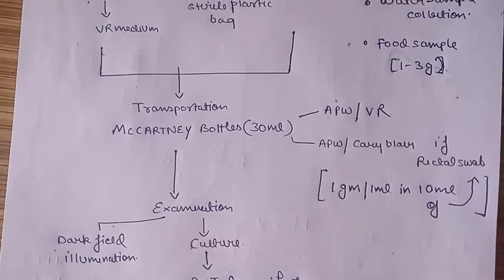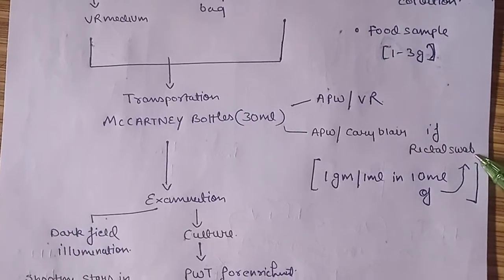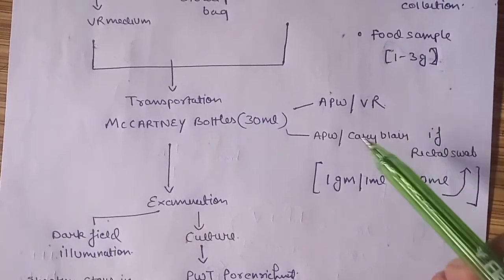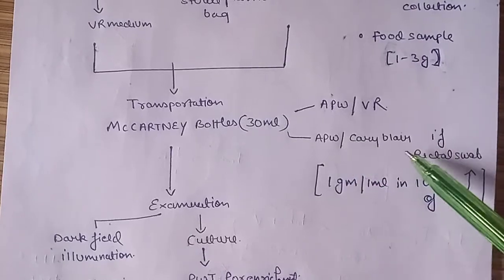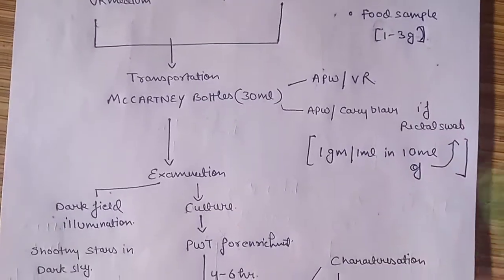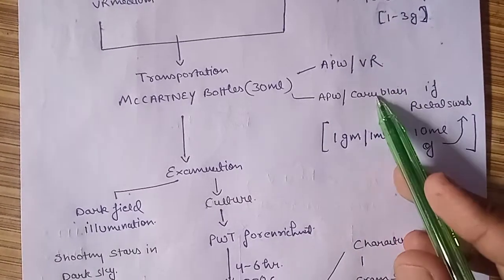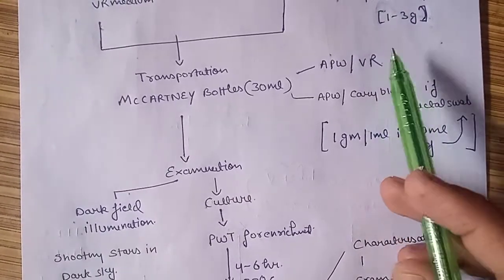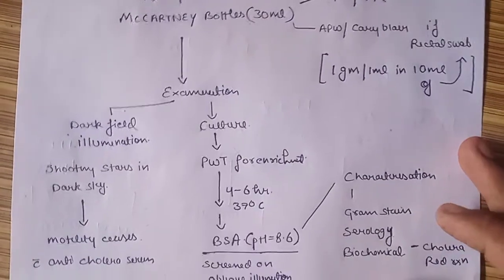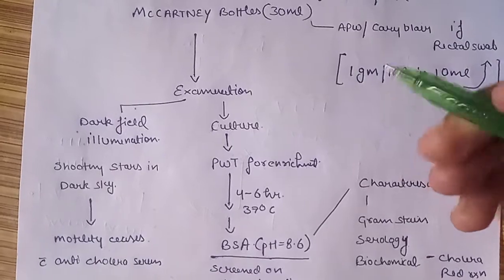Especially, mind you, in the case the sample is taken through rectal swab, we do collect the sample in alkaline peptone water or Cary-Blair containing McCartney bottles. And the sample is around 1 gram or 1 ml in 10 ml of the respective alkaline peptone water or VR medium. Okay, so after this collection, we examine the sample.